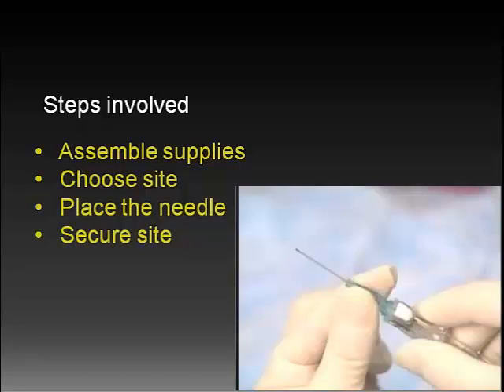Gently pull the skin in the direction opposite that of the needle being placed with the other hand — this will facilitate entry through the skin. Forward resistance is lost once the skin is penetrated. Decrease the angle and direct it toward the vein. As soon as the needle enters the vein, blood will enter the flashback visualization chamber. Next, advance the needle just a few millimeters into the vessel. Advance the catheter hub slightly away from the needle and release the tourniquet. Continue to advance just the catheter hub three-quarters of the way over the needle, but not completely off — this is often referred to as hooding.